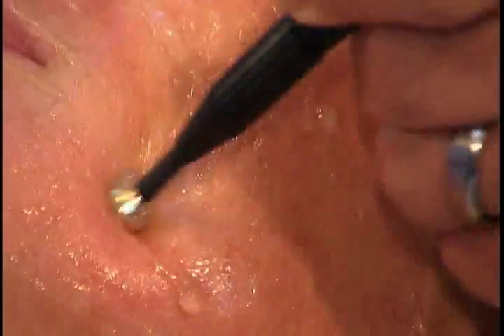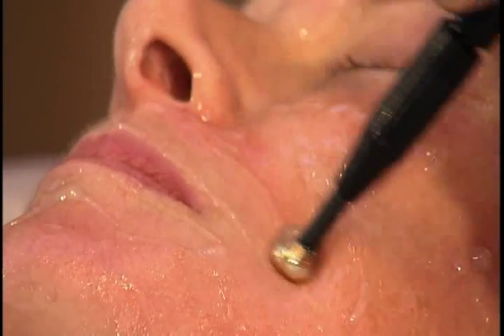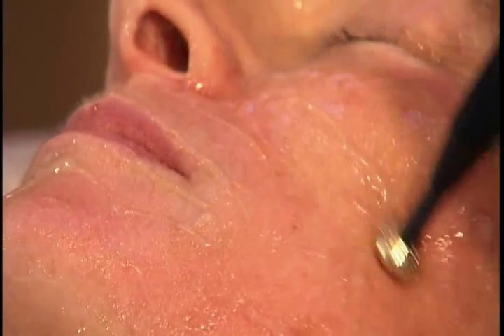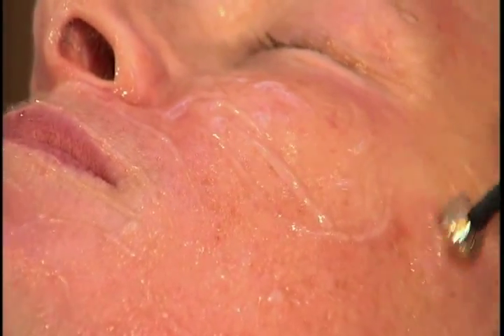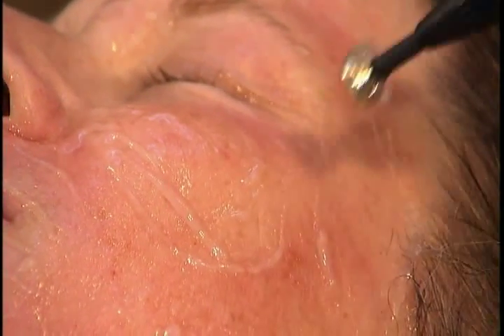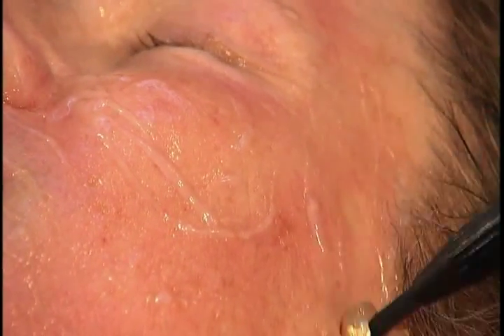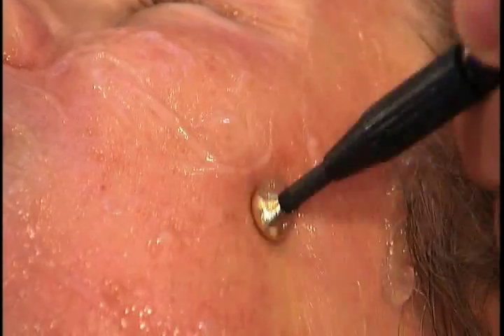So this is about the third time I've had to go over it to get it up to temperature, and you see she's reacted already a little, and I've persisted just because I want to make sure I have the whole treatment area. And on the temple, now that you've turned it up and you're going back on the temple, which is relatively sensitive, you hear me going on and off, and I'm just treating more gingerly there. So let's see.